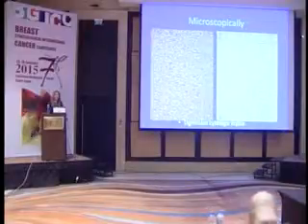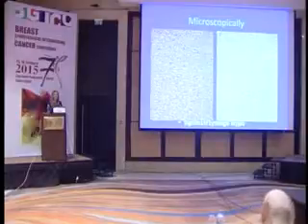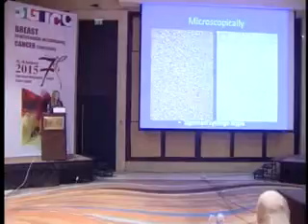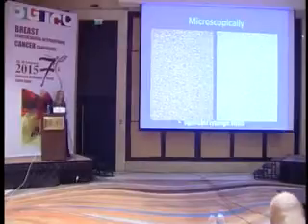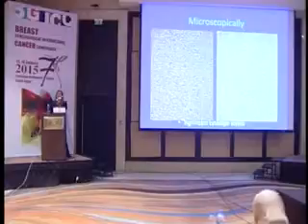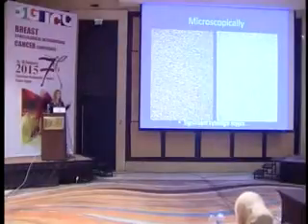Microscopically, do I have to tell you anything about the story? So, what's your diagnosis? Leiomyosarcoma. Leiomyosarcoma? Yeah. Leiomyosarcoma. And what do I need to call it leiomyosarcoma? To have a classic leiomyosarcoma, I need three things. Significant cytologic atypia from low power. Low power. Mitosis.